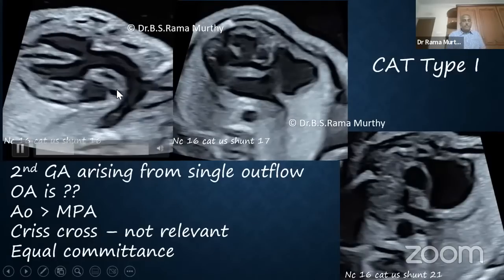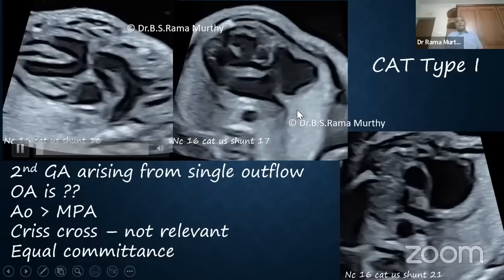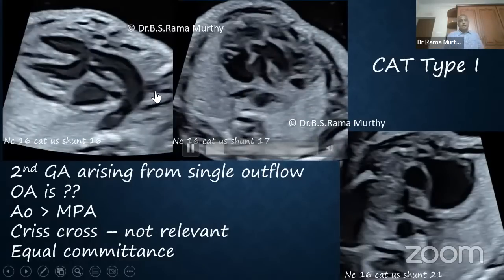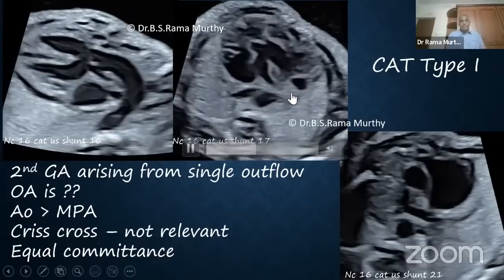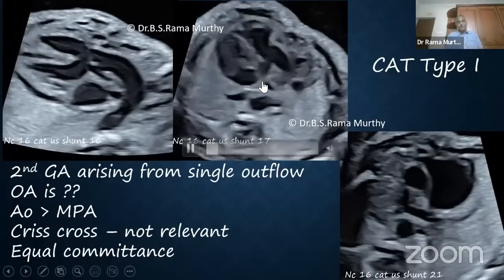So now if I were to call this the pulmonary artery, I must rotate the transducer and try to get other views. The first view I get when I go axial, this was oblique, the LVOT is a parasternal oblique view, this is axial. You find that this is the common arterial trunk. That is the truncal valve, which is abnormally thick. That is the aorta, which is larger caliber. This is the pulmonary artery, which is smaller caliber.